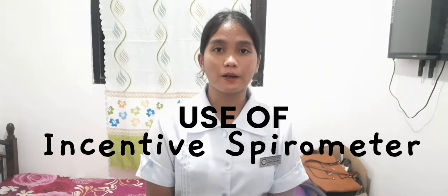Hi, I am Sheila Marie De La Cruz from BSN 3B. In this return demonstration, I will show and explain the use of incentive spirometry.